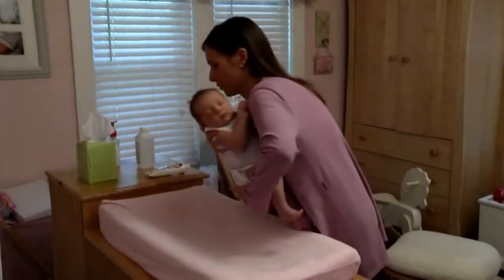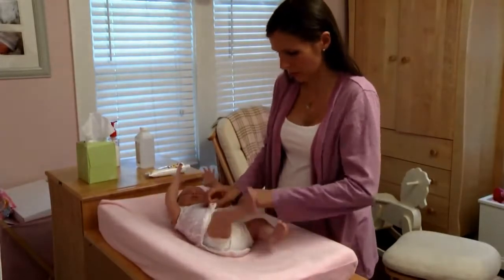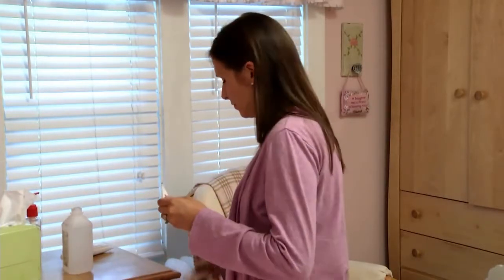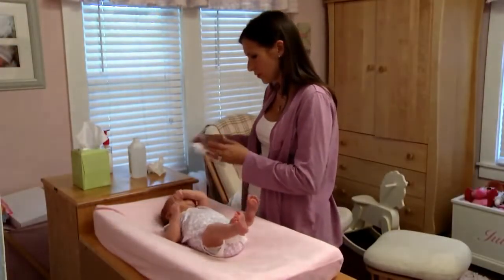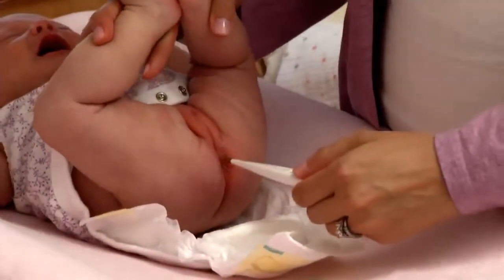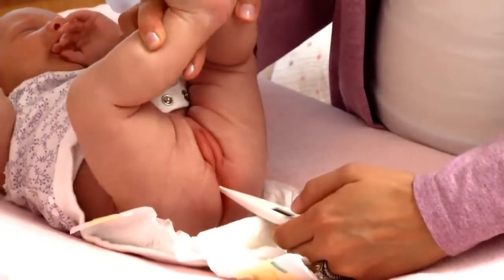To start, place your baby down face up on a firm surface — a table or changing table is fine. Loosen the diaper. Clean the end of the digital thermometer using a tissue with rubbing alcohol or soap and cool water. Do not wash or rinse it with hot water. Then place a small amount of lubricant on the end, such as petroleum jelly. Then turn the thermometer on, making sure it's powered up. Next, bend the baby's legs toward the chest and insert the end one half inch to one inch into the baby's anal opening.